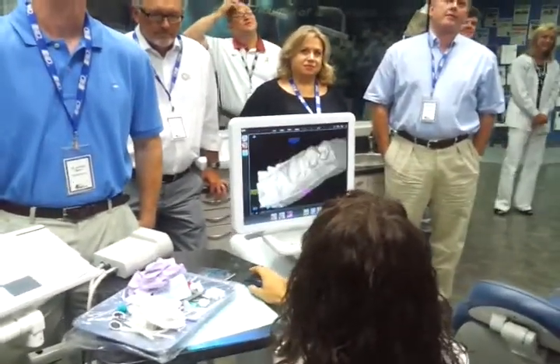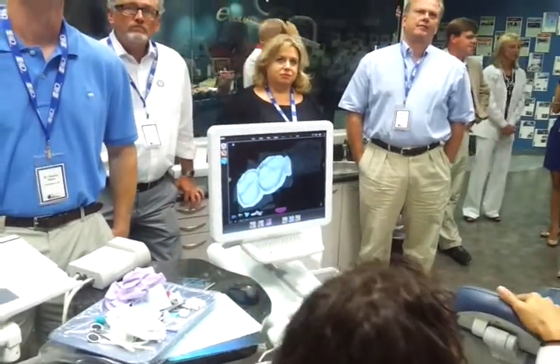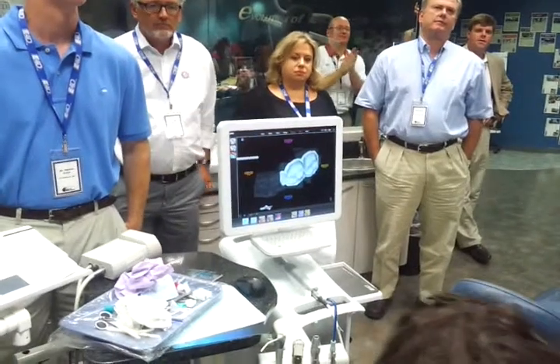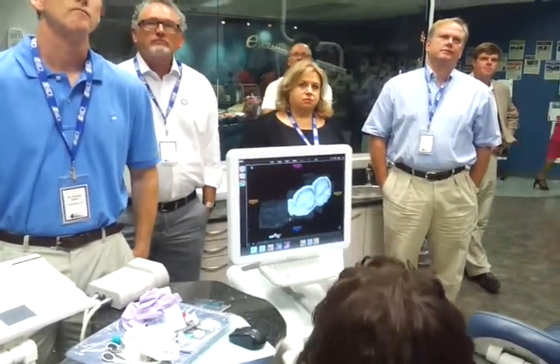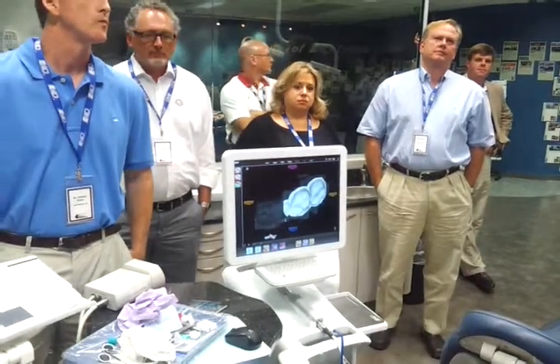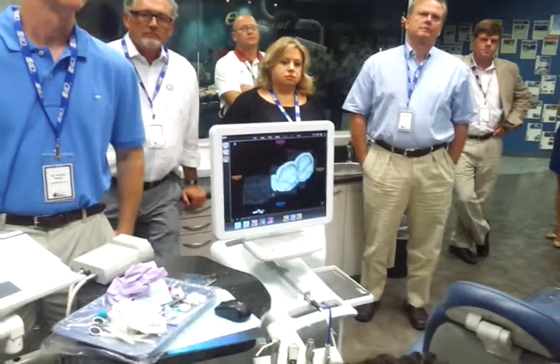Alright, so what I'll do now with this data is go to my bite scans. Obviously normally Gary would still be in the chair. I would have scanned in the bite. I'll just reset this scan here for you so you can see what it looks like. When you're scanning in the bite, what you're going to be doing is just capturing the occlusal data. Think of it like occlusal paper.